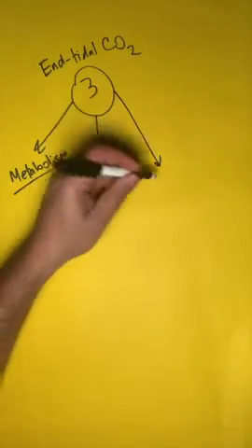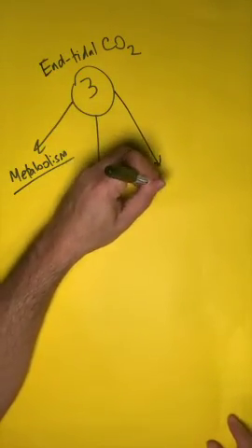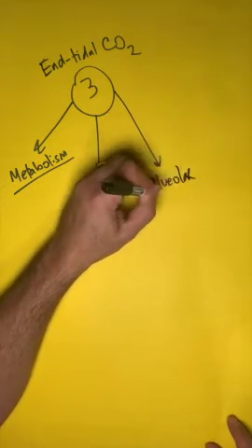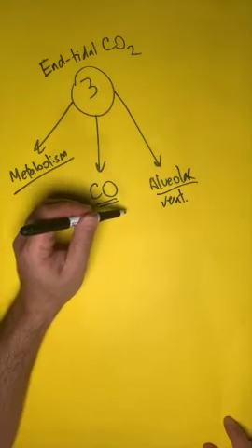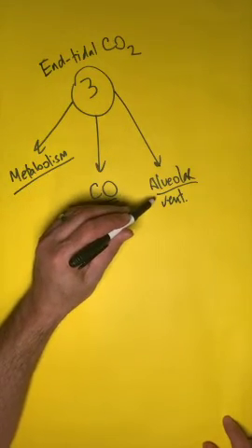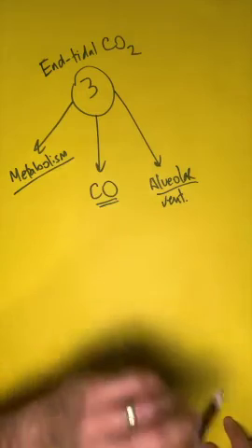And the last thing we're going to need is working alveolar units, or lungs. We're going to have the patient ventilate in order to push that CO2 that got perfused to the lungs back into the alveolar units, up through the trachea, into our detector.